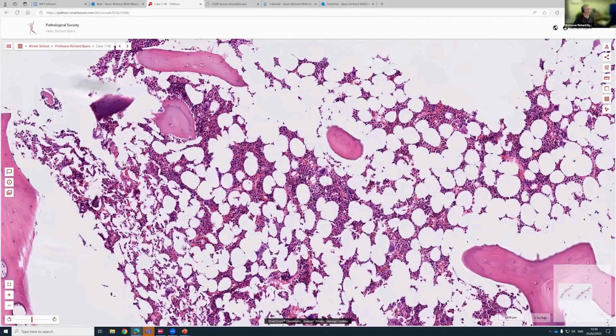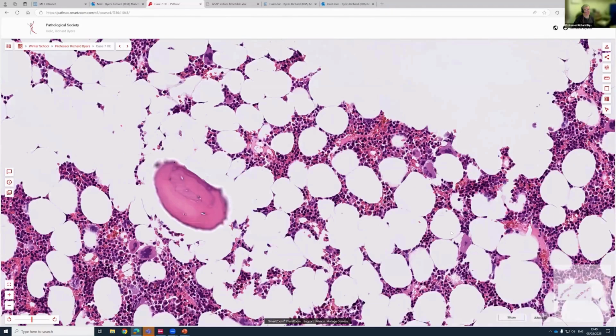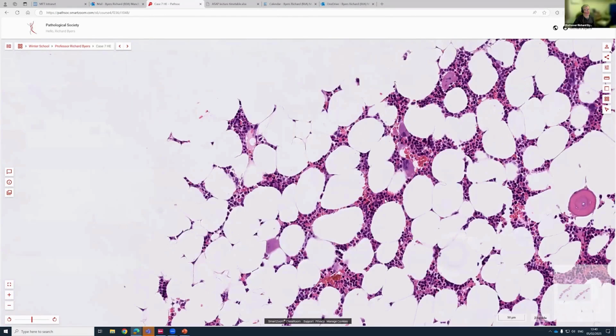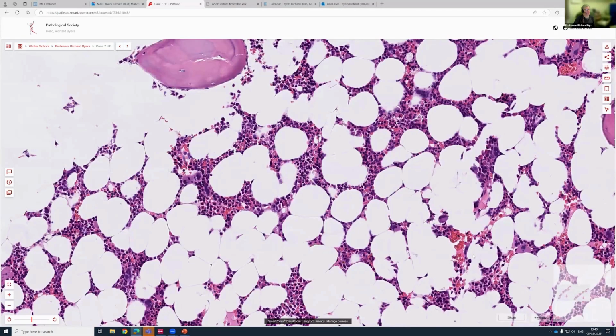So this case here, it's not as busy as the other myeloproliferative neoplasm we've seen, but you can see we've got some abnormal megakaryocytes. They look cytologically abnormal. We've got small little clusters. These look abnormal here as well. Got a little cluster here, and another little cluster there.